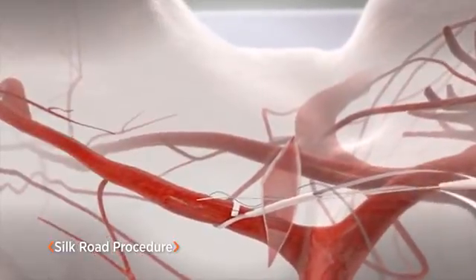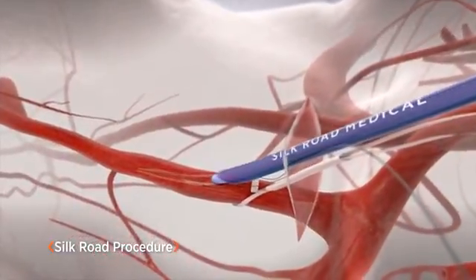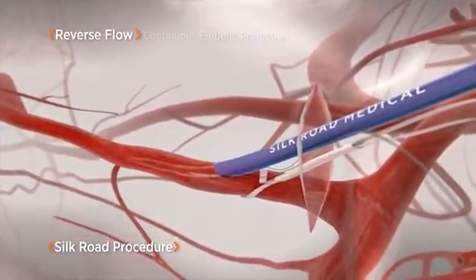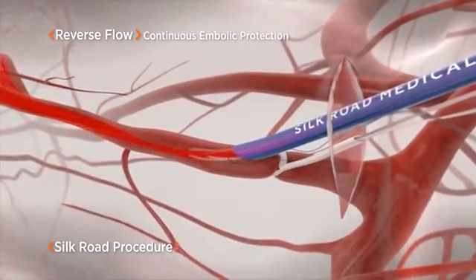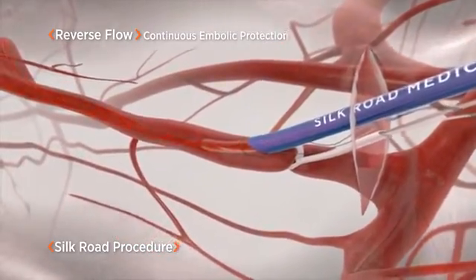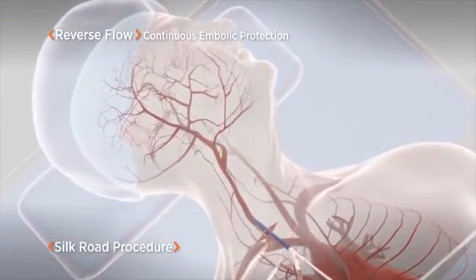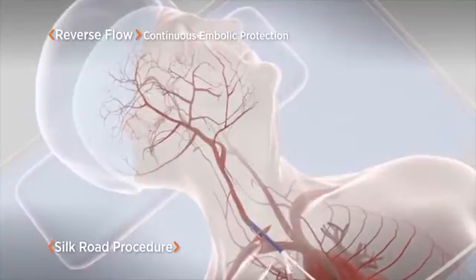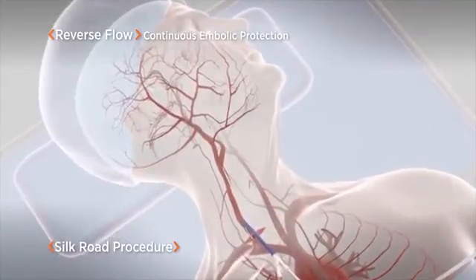A specialized sheath is placed through a small puncture in the artery. This sheath will be used to deliver a stent, but first it will temporarily reverse blood flow in the artery. Flow reversal keeps debris moving away from the brain, protecting it from dangerous emboli.